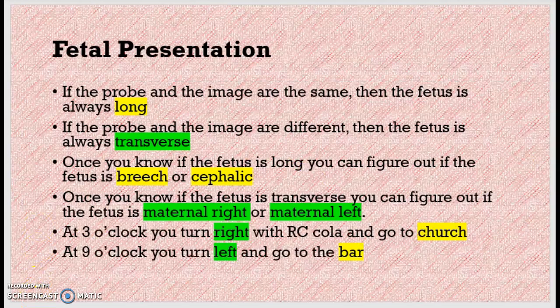With fetal presentation, I know this slide looks a little messy. I tried color coding these.